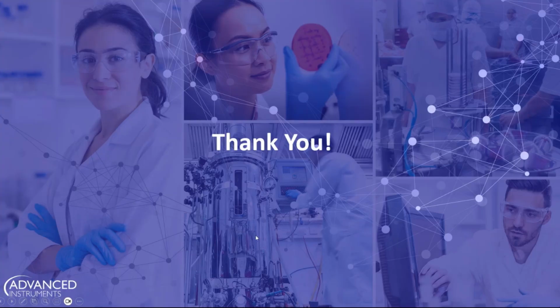All right, that was a lot of information in a little bit of time. Questions? I already see we have someone in the chat that asked a question. Beautiful. Thank you, Karina. Is the GloCyte instrument manufactured in the US? Yes, it is. Our headquarters are based out of Norwood, Massachusetts. That's where we manufacture the GloCyte.